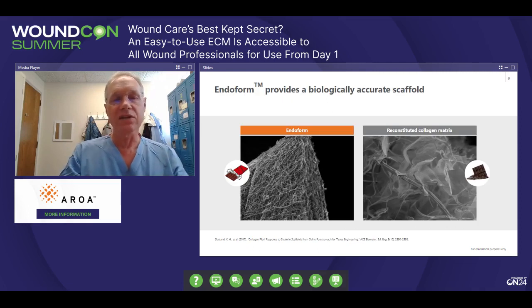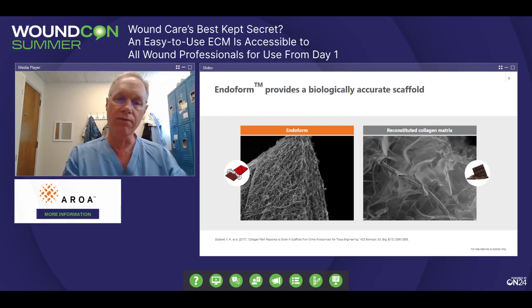So again, the analogy here is like a chocolate bar. If you have a chocolate bar that is intact, obviously that's the one you want to eat. If you got one that's melting, it becomes more amorphous, clearly changes the structure, changes the taste. So that's the analogy: you're looking for structure versus an amorphous quality.